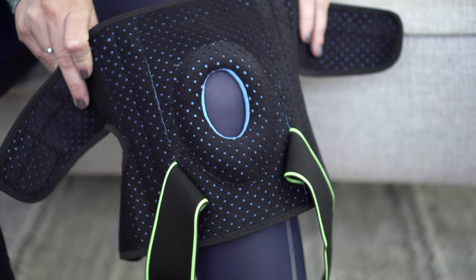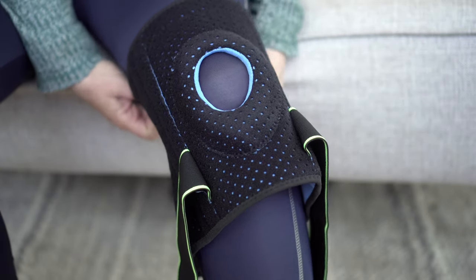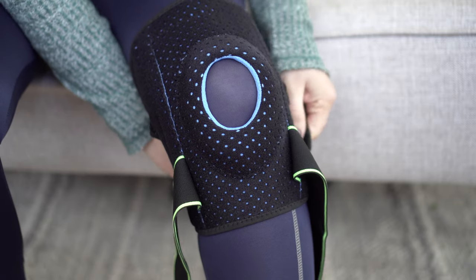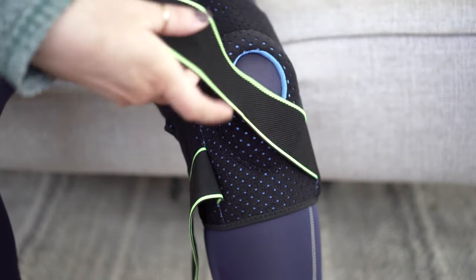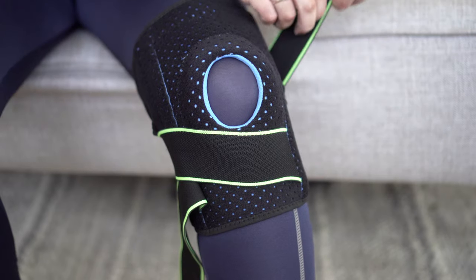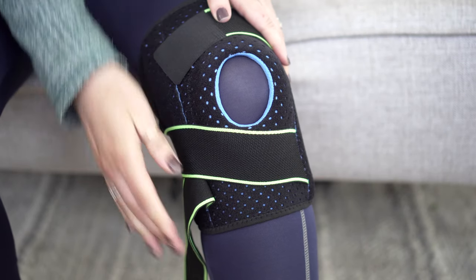It is very easy to put on. First, place the knee brace over the kneecap ensuring that the opening is aligned to the patella. Wrap the upper wrap-around strap, then do the same with the bottom strap. Next, bring the elastic strap behind your knee, back over to the front, and secure it with the velcro tab. Do the same thing with the other strap.